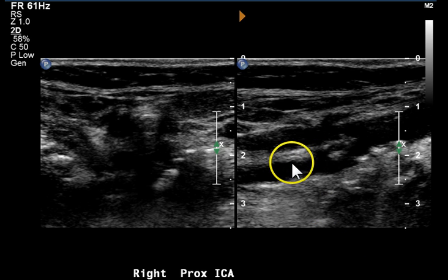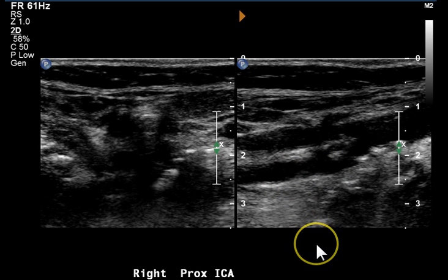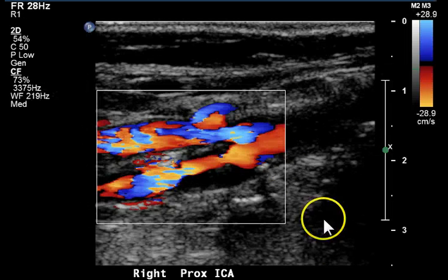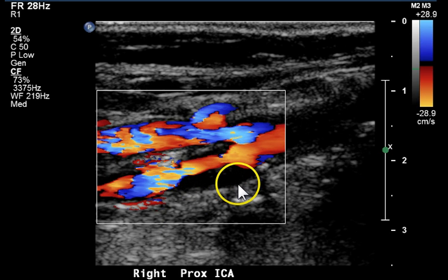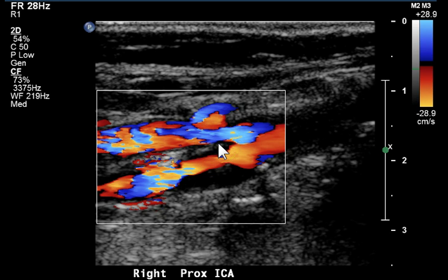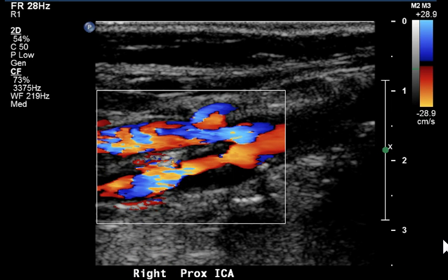The hypoechoic plaque producing this small area of flow lumen is not well appreciated on the grayscale image, but can be seen very nicely on the color Doppler image. Here we see a large area of hypoechoic homogeneous plaque, with a smaller area in the anterior portion of the vessel. This mixture of colors is sometimes known as the color confetti sign, which is a sign of turbulence.